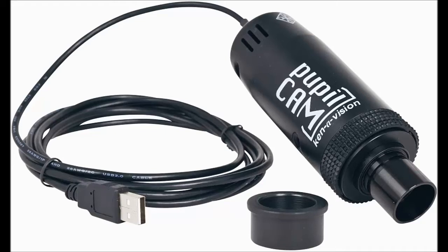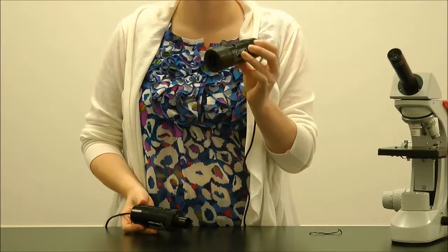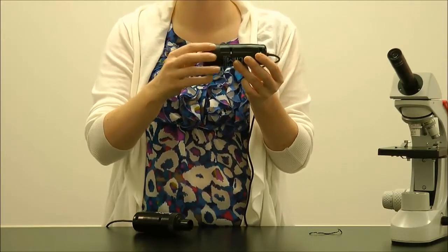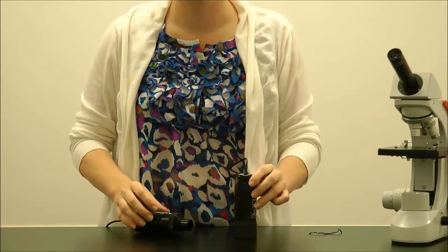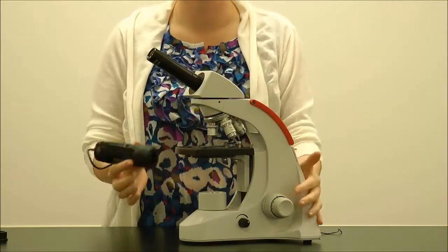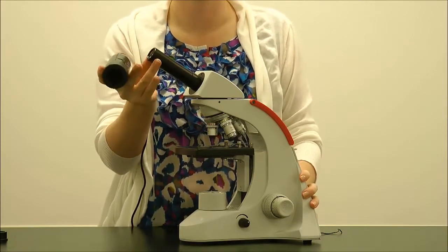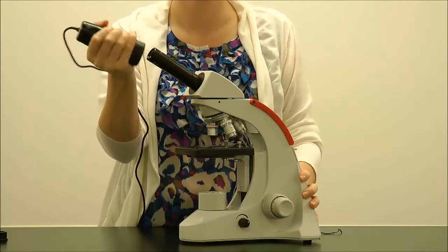To demonstrate with the 1401K-RM PupilCam with the rubber adapter, you will need a compound microscope with an eyepiece diameter of 28 millimeters. It is very simple. Take the 1401K-RM PupilCam and gently slide with a back-and-forth motion all the way down the compound microscope's eyepiece and body tube until the PupilCam will not slide anymore.